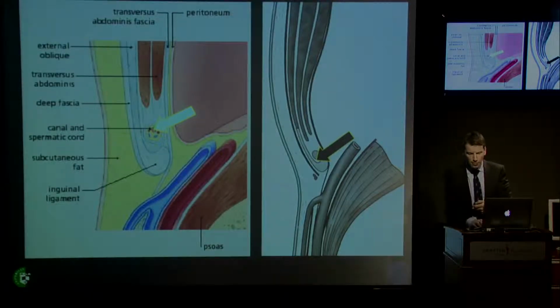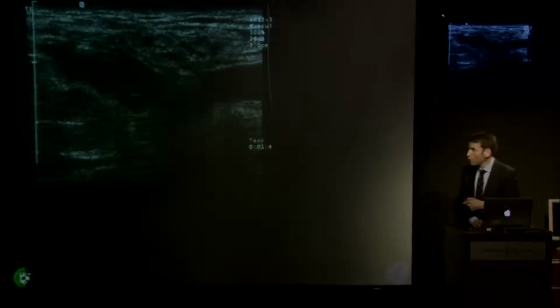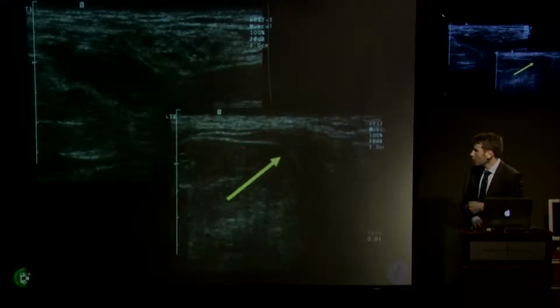So there's no hernia. And this is what it looks like on ultrasound. Here we have the canal with the tubes coming out at you, various blood vessels and cords. We've got psoas here, and here we've got bowel and peritoneum. And when the player strains, it causes compression.